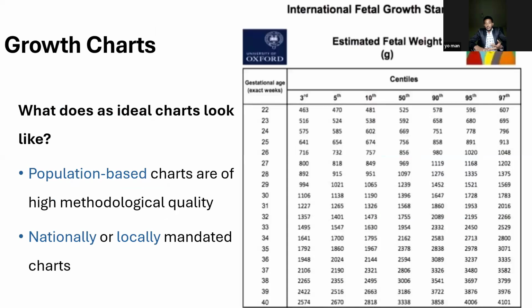So we have the exact gestational age, and we obtained the ultrasound biometry. What's left? We have to check those parameters with respect to the exact gestational age. I know that there are a lot of growth charts available on the internet, but the most recommended growth chart that I recommend is the INTERGROWTH-21st Century research, which took into account a lot of population data, which are highly methodological.